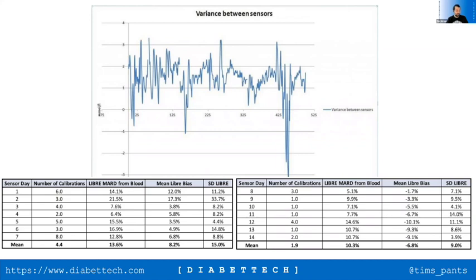I always took the discussions around turning on extra smoothing with a pinch of salt because I felt that it was really about the important thing about using the Libre with MiaoMiao, that you don't really want your glucose levels jumping around all over the place, and that's not really about smoothing. That's about hoping that the system you're using with it is going to manage it better. But I would leave that as an open point, and maybe something we can come back to or find out a bit more about if anybody wants to do that.